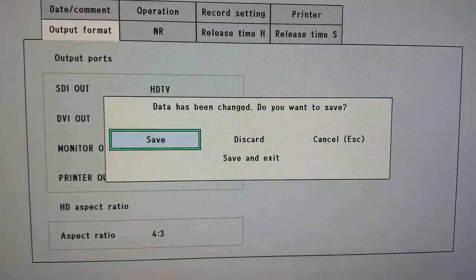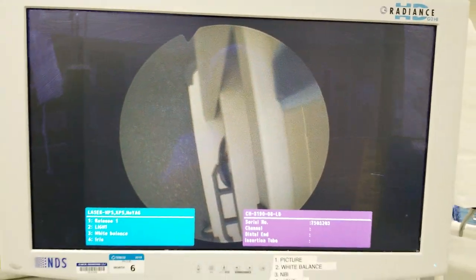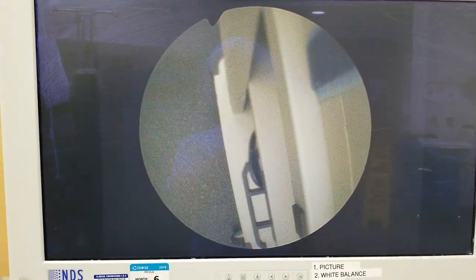Now hit Menu again and you want to save. Hit Enter to save, and look at that — you now see the entire cystoscopic image on the screen. This is the correct setup. Olympus needs to learn how to set these up correctly in the OR.